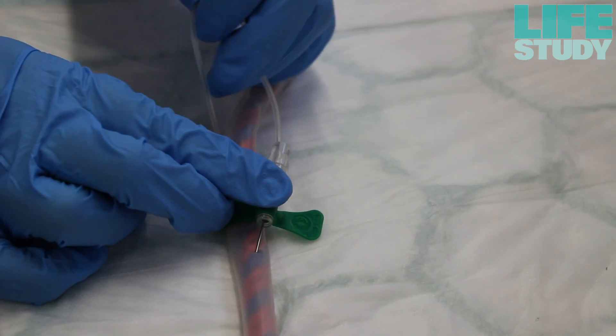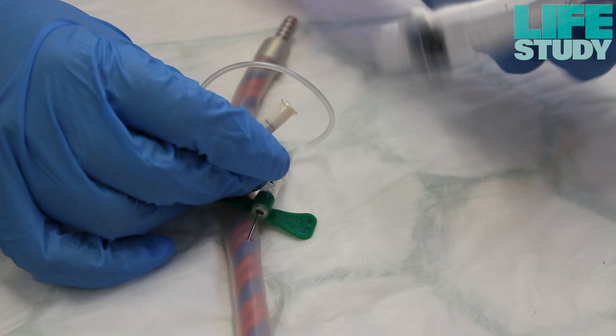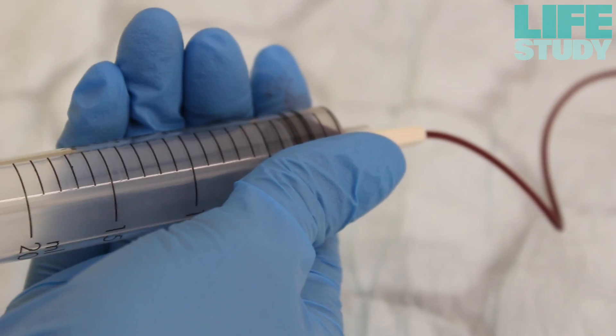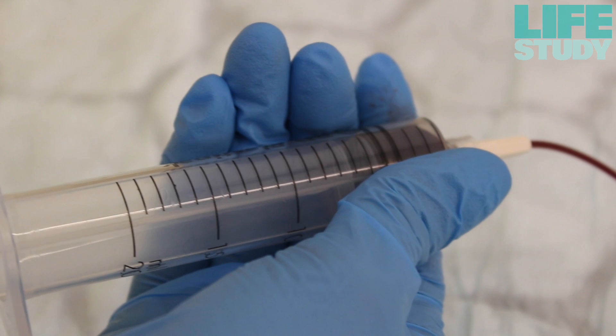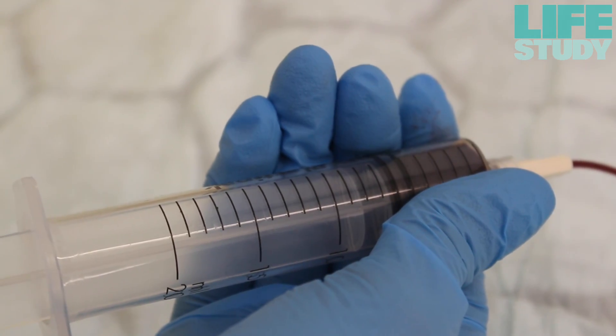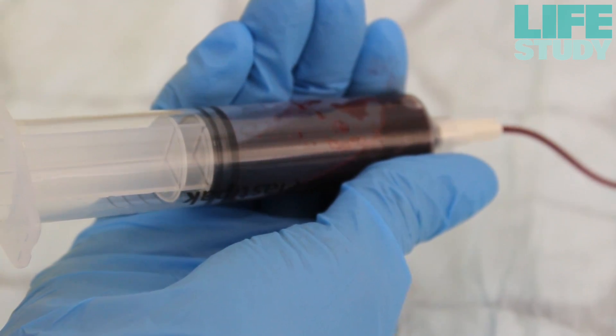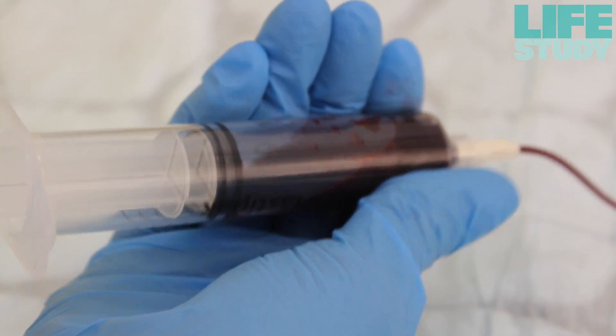Using professional judgement on the cord quality and blood volume in the cord, attach a 20ml syringe to the butterfly tubing. Fill the syringe with cord blood, avoiding drawing air bubbles through the syringe as much as possible. Air bubbles damage the blood cells. Some cords may require more than one puncture in order to collect all available blood.